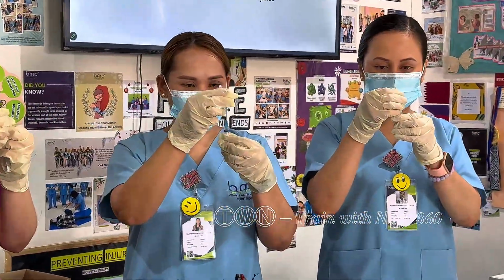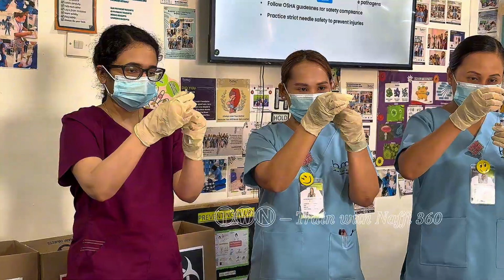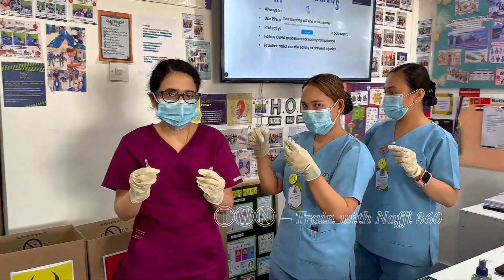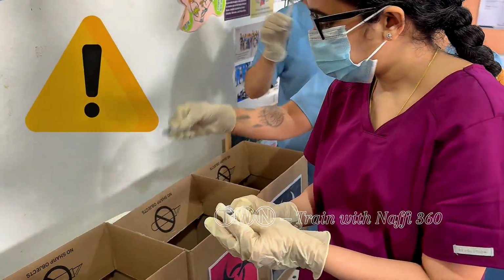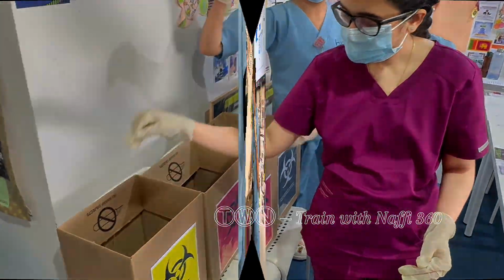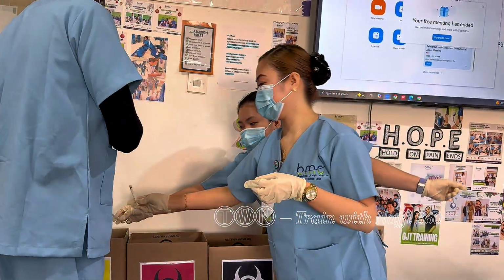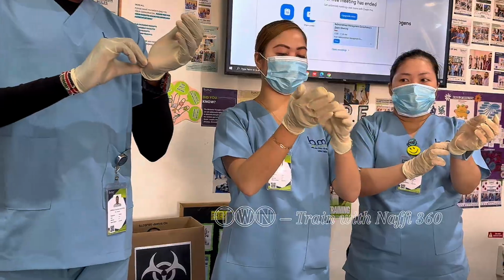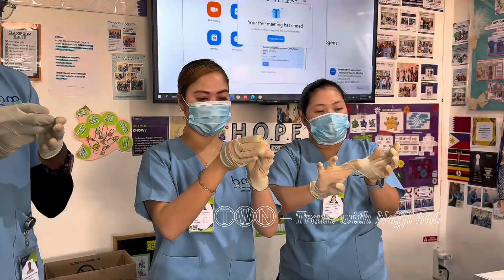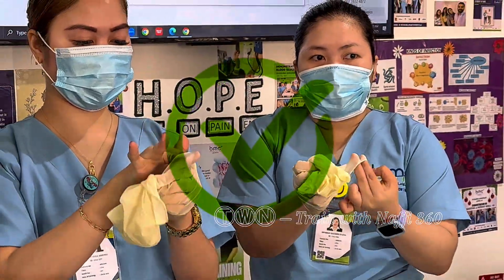Now, the students are practicing how to properly check the needle before use. Each student carefully inspects the packaging, making sure it is sealed and undamaged. They also practice the proper disposal methods after use. The entire needle along with the holder is placed directly into the sharps container, and other devices go to the relevant designated containers as follows. They also demonstrate the correct method of removing gloves and perform hand sanitization afterwards.